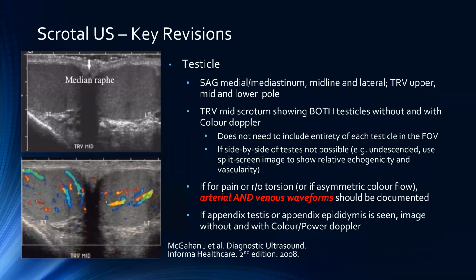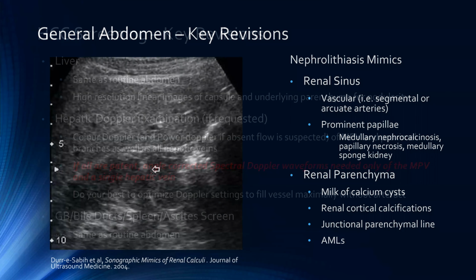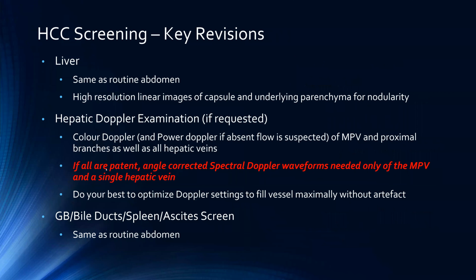So, sorry again, just to go back to the HCC. Oh, sorry, that's correct, so we do include those spectral Doppler waveforms. Oh, sorry, no, it is again only if requested. The hepatic Doppler examination is going to be included in the HCC screening.